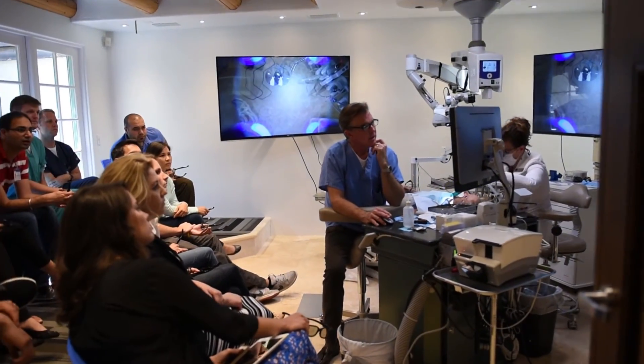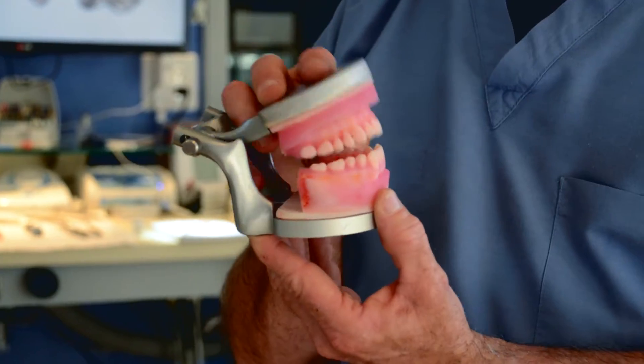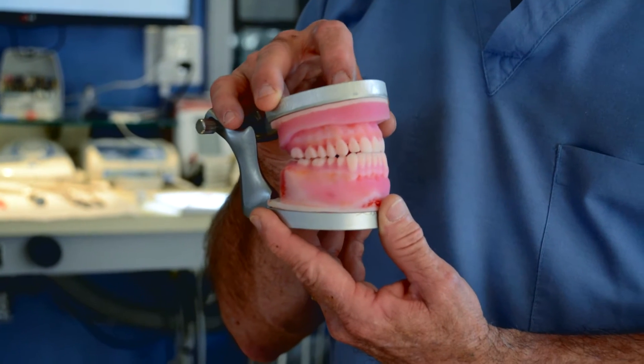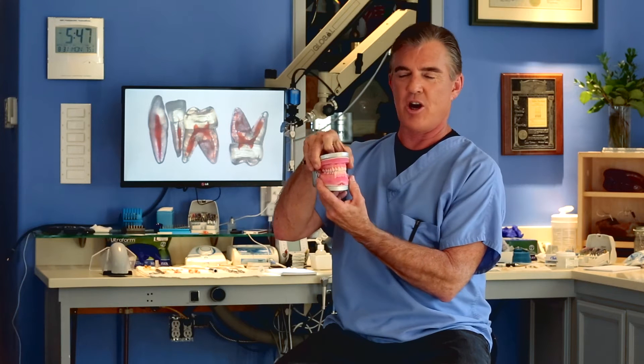As an educator I love to teach, and this is the coolest thing I've ever used in teaching endodontic procedures. My latest project with 3D printing is printing whole jaws that fit in articulators. We've all worked in typodonts — typodonts are idealized forms, kind of an average of everybody's teeth but not really like anybody's specific teeth. This is the real anatomy. This is actually somebody I know very well.